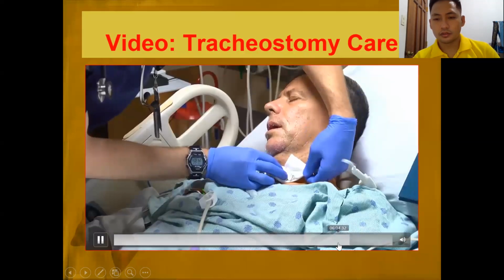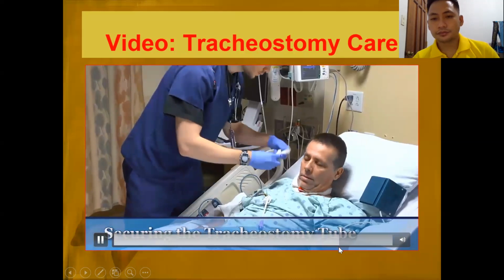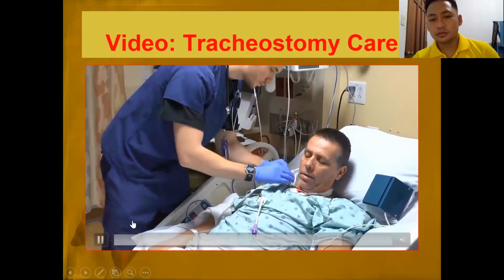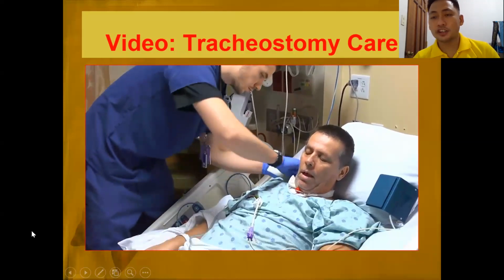Either side of the trachea. You may want an assistant to hold the tracheostomy tube as you work, if an assistant is not available. So we have two options in changing the tracheostomy collar. Itong nakatali dyan sa kanya to secure the tracheostomy. Kapag dalawa kayo, pwede ang isa i-hold niya habang tinanggal mo yung old collar.